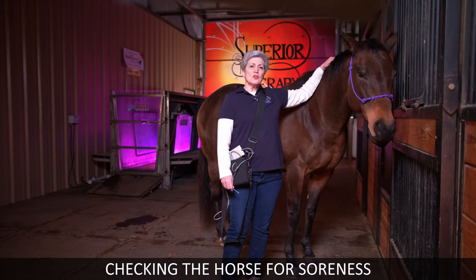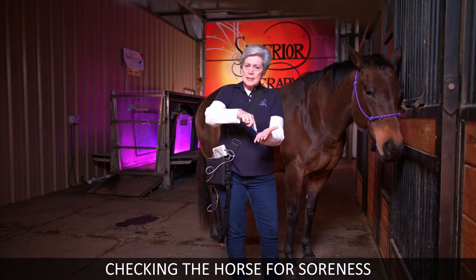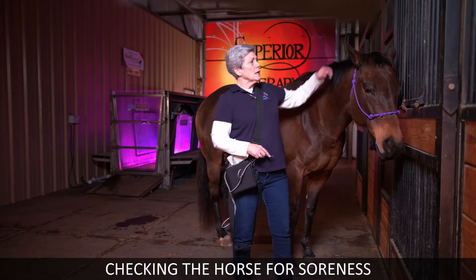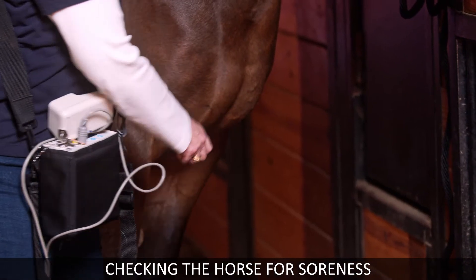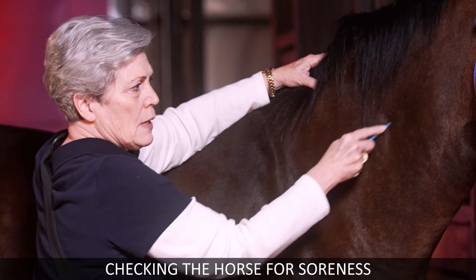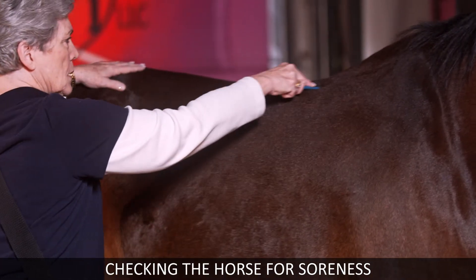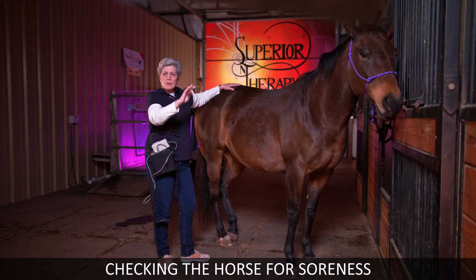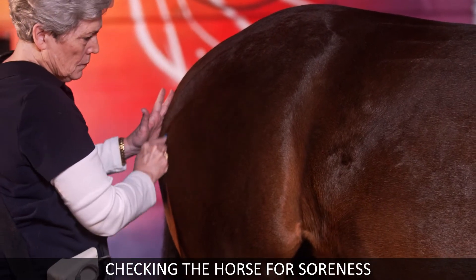Use a smooth ballpoint pen or something smooth, press down — not dig down. You can make any horse flinch, but you want to get a true reading. First, check the poll, then check down between the legs — you want that to be loose. Then make three lines across the back.